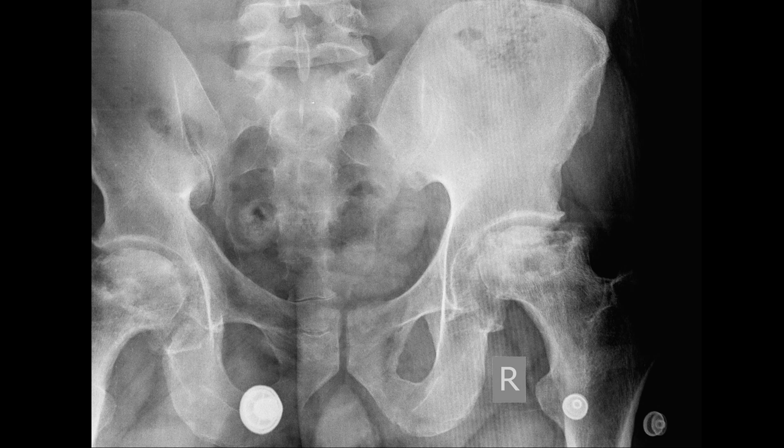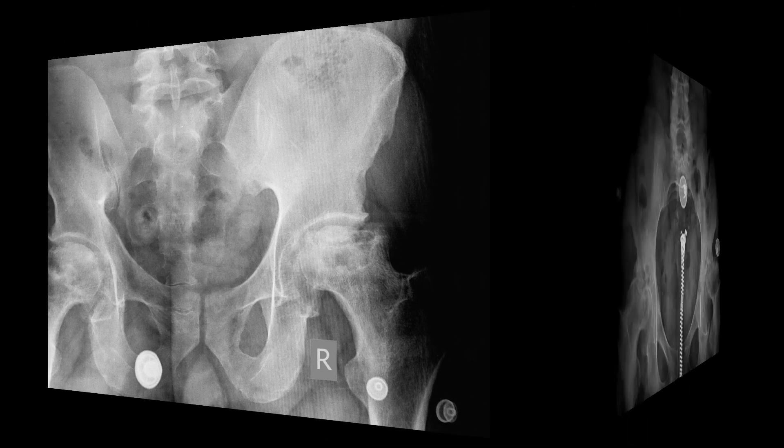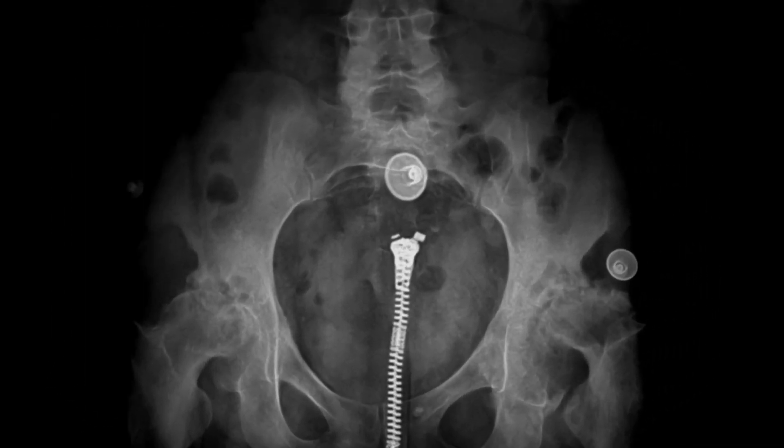Notice advanced degenerative changes compared to the contralateral side, including moderate to severe loss of the superior lateral femoral acetabular joint space and mild osteophytic ridging of the acetabulum and femoral head. This next patient presented with bilateral hip pain — notice bilateral avascular necrosis with visible subchondral fractures and deformity. This patient has a known history of chronic corticosteroid use, with bilateral flattening and deformity of both femoral heads and prominent subchondral cyst formation.